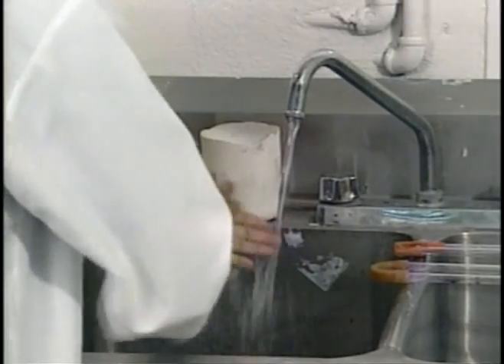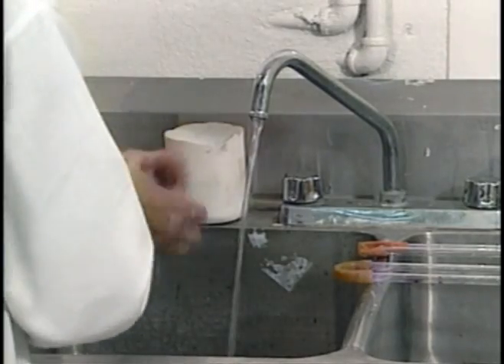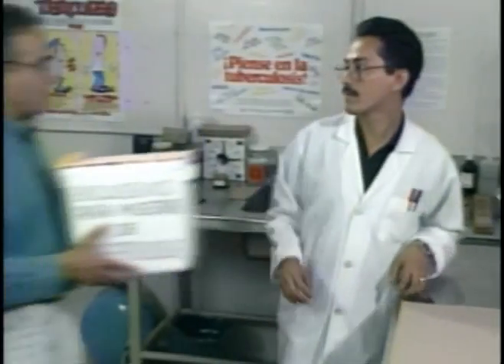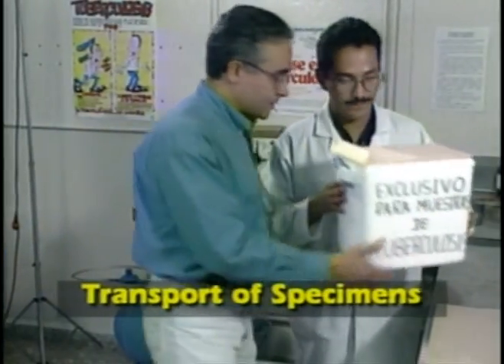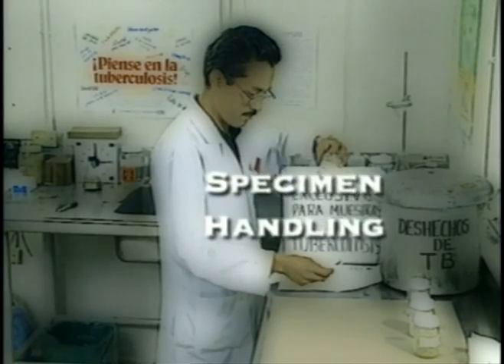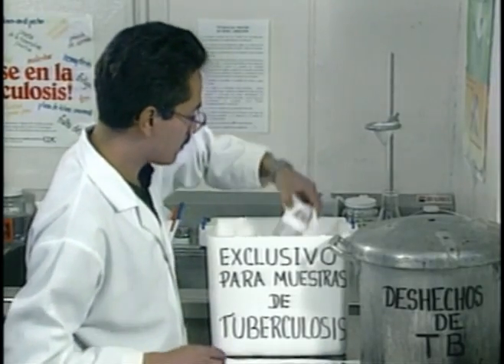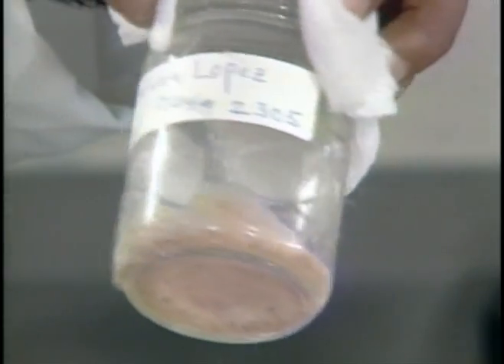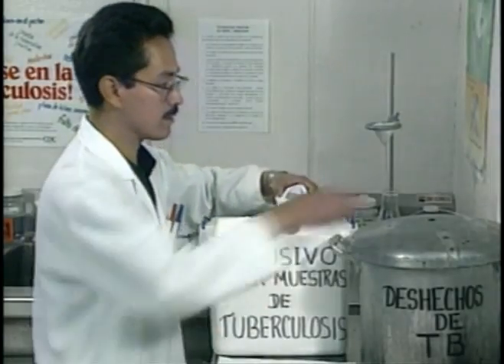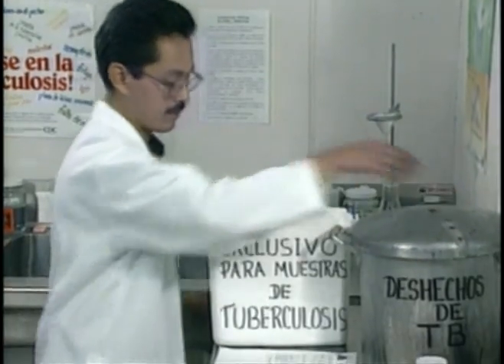Always wash hands with soap and water after handling specimens and containers. Specimens should be packed and transported according to your country's NTP guidelines. Open the transport box carefully and examine it for cracked or broken containers. Discard any broken or leaking container and request another specimen.